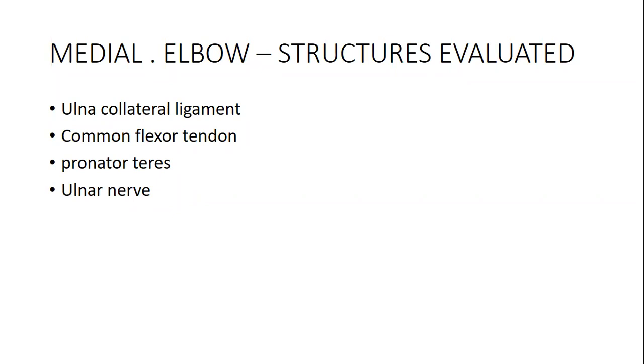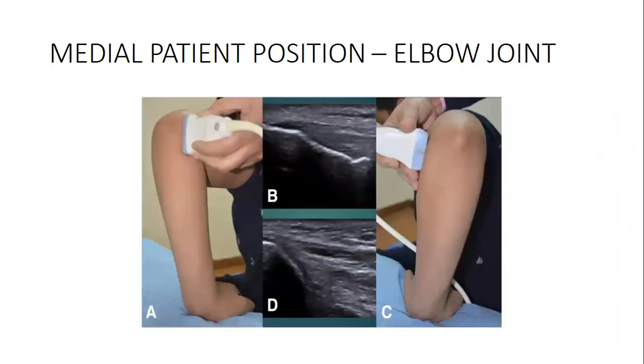If you start doing things haphazardly, you are likely to mess up. So be systematic, be methodical, know exactly what you are assessing within the medial portion. Again, I'll still repeat, if your anatomy is not thorough, if you are not solid in the anatomy of the medial compartment, you are going to miss things. How do you do it? There are methods that you can use.